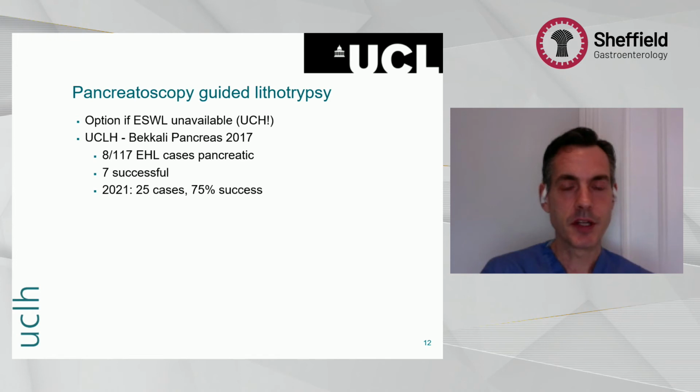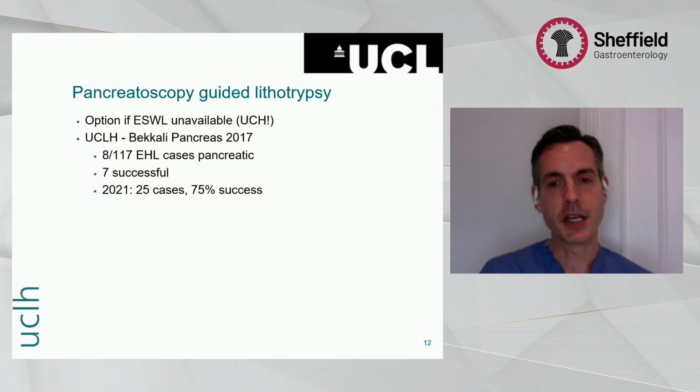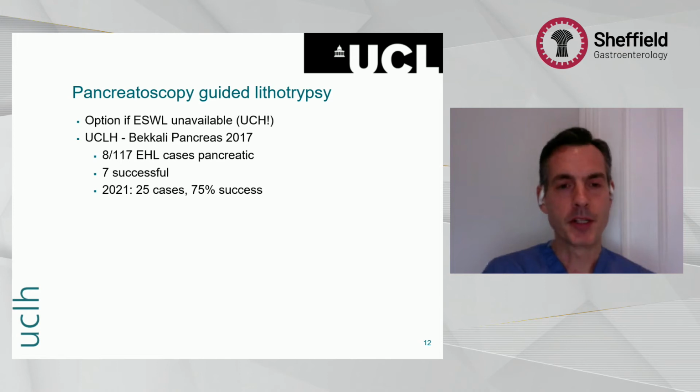However, we've pretty much moved to pancreatoscopy guided lithotripsy using the SpyGlass system from Boston. So ESG say this is a fine option if ESWL is unavailable, but given that our lithotripsy service and our urologists are based at a different building, and a different hospital several blocks away, we've never particularly got on well with it. And since the advent of SPY, particularly the latest SPY, we've demonstrated significant success using EHL within the pancreas. So this was our case series of all our EHL cases in 2017.